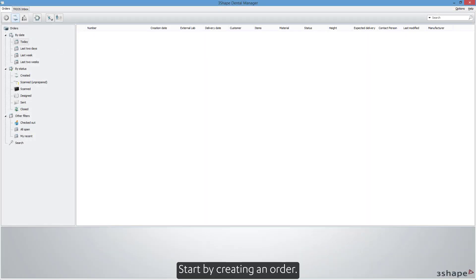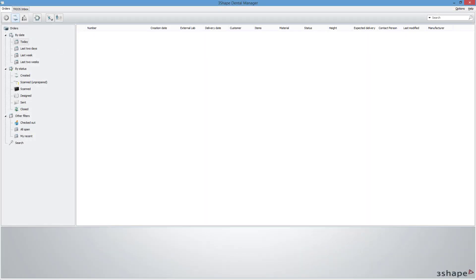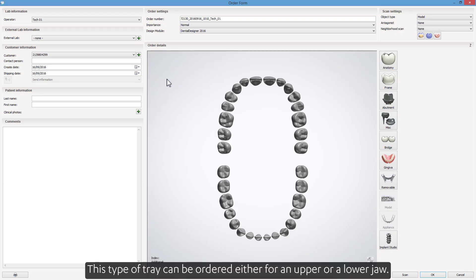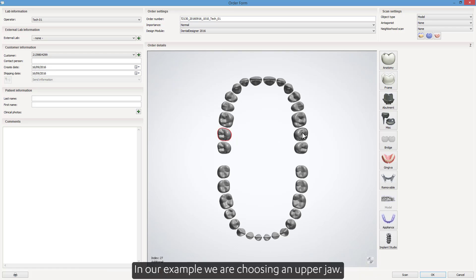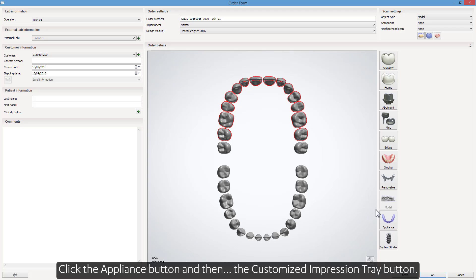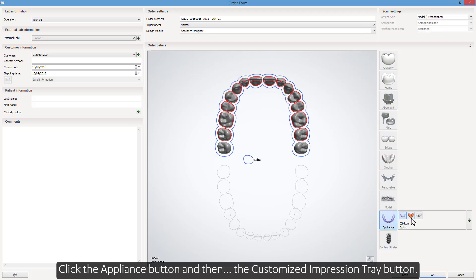Start by creating an order. This type of tray can be ordered either for an upper or a lower jaw. In our example, we are choosing an upper jaw. Click the appliance button and then the customized impression tray button.